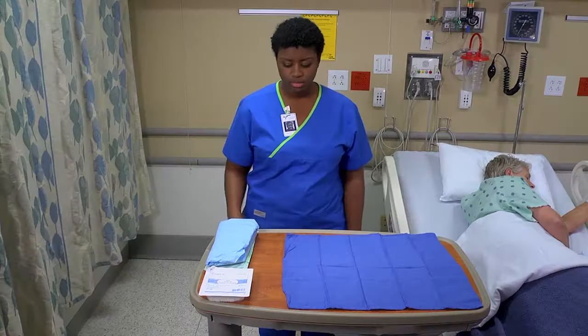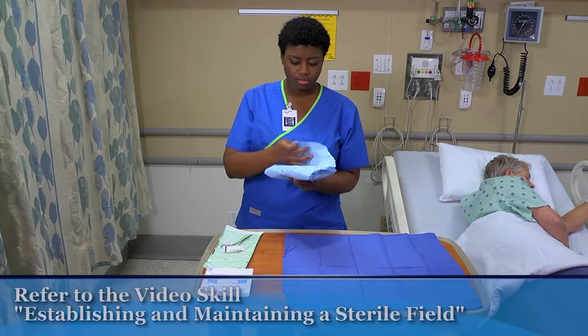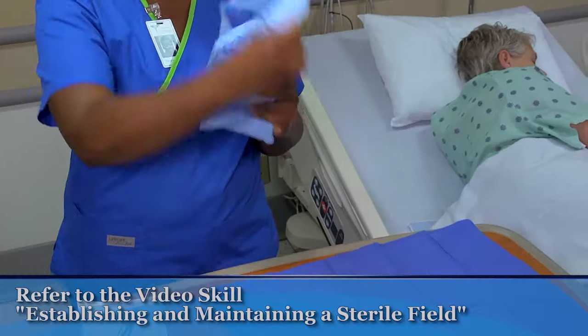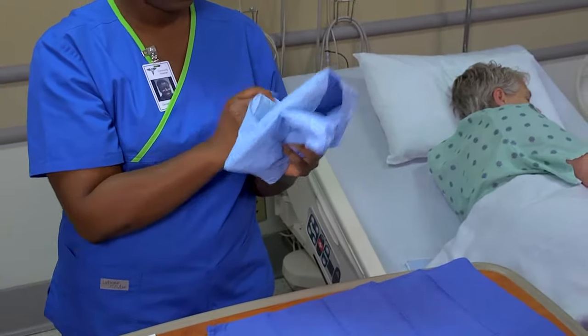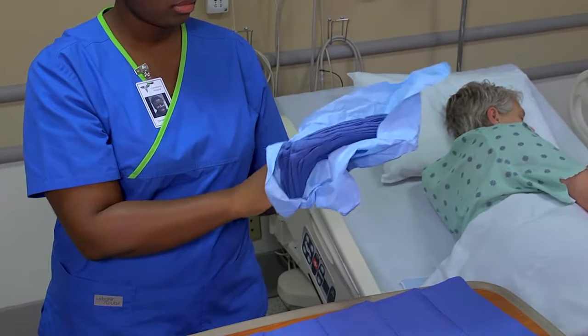Begin by setting up your sterile work surface, as shown in the video skill establishing and maintaining a sterile field. When your sterile field has been prepared and you're ready to add a sterile item to it, open the item according to the package directions.